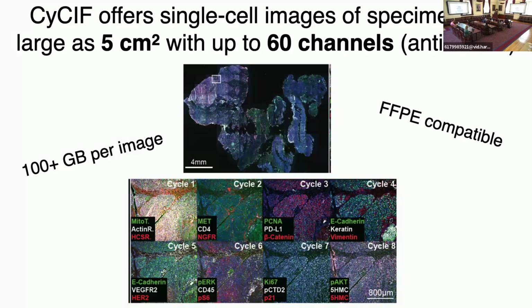Validating antibodies for this technique is a chore. We've gone through a lot of that. We try to make that information shared as publicly as much as possible. But finding the right antibodies that are compatible with the optical setup on your microscope and have epitopes that you're interested in imaging in your sample, 60 channels usually tends to be about the max.